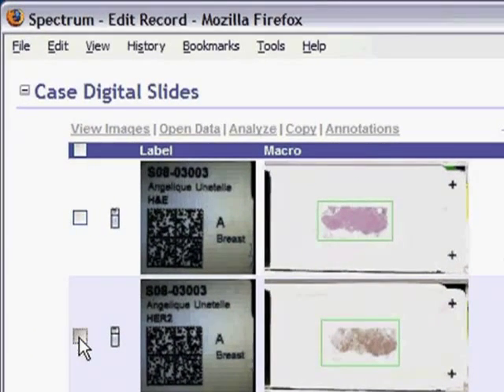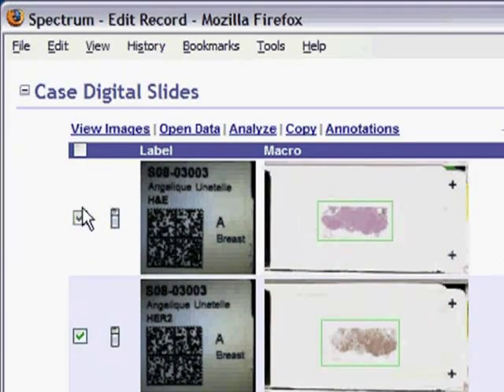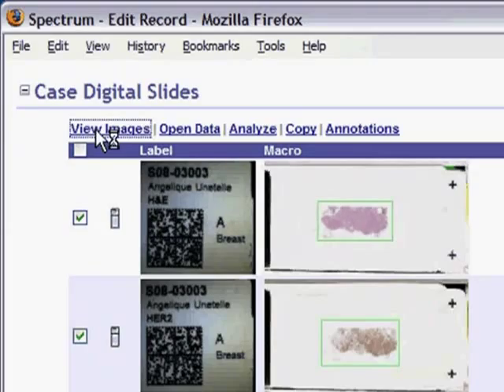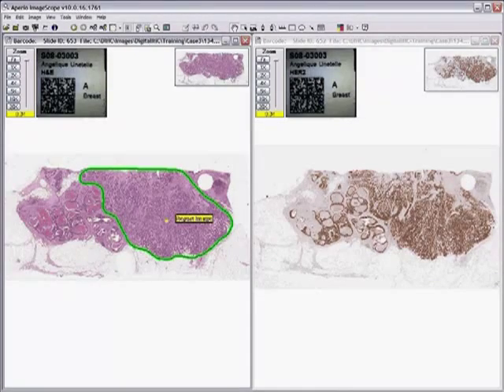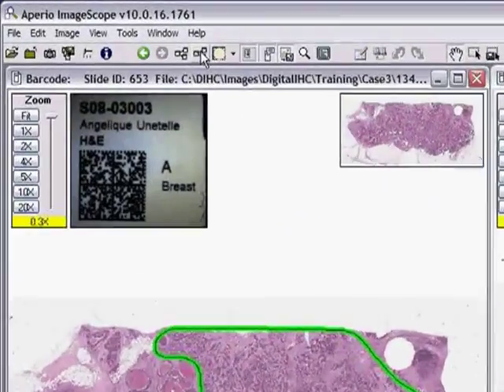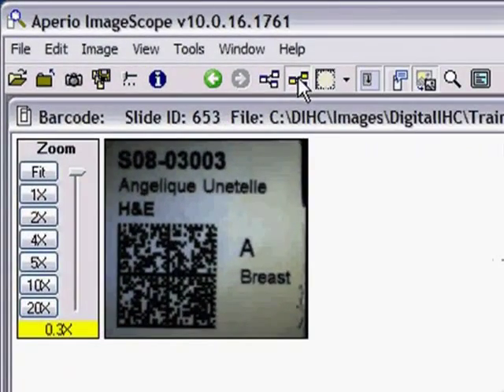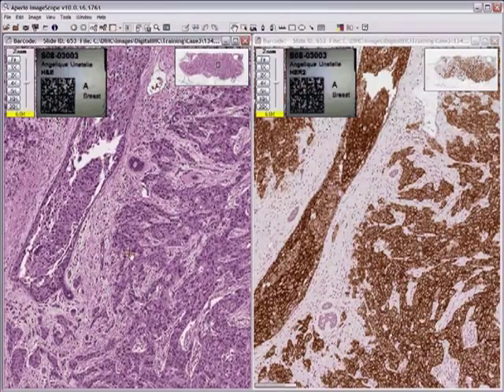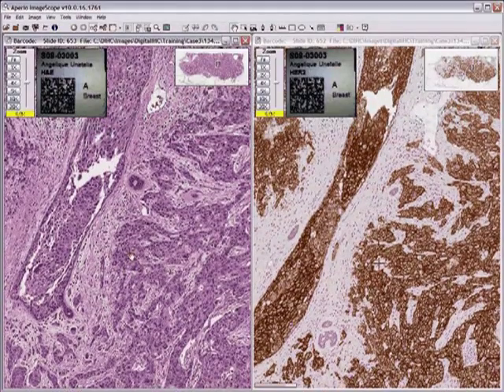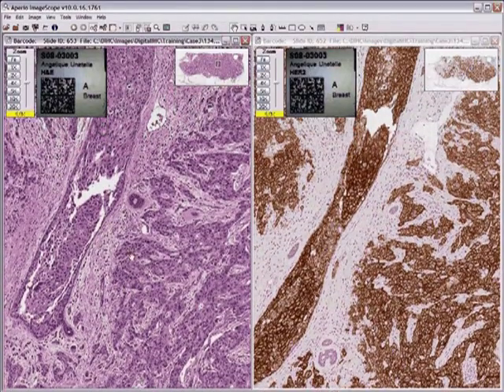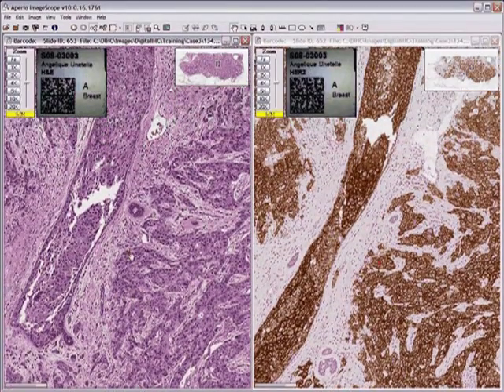Something you cannot do in a microscope is to view multiple slides side by side. Being able to look at the H&E and the IHC slides simultaneously will help you identify the tumor regions faster and more reliably.